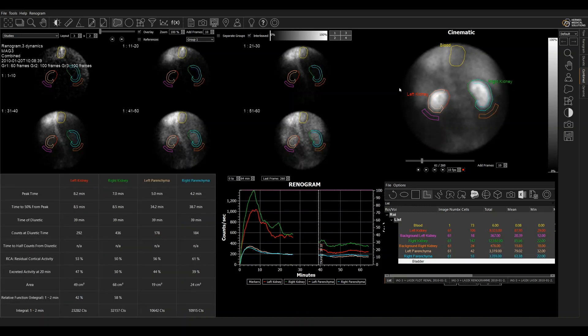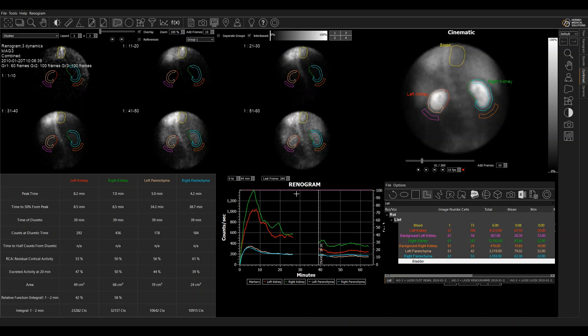So now you can see there's a nice feature in this application where if the renogram acquisition was done in two parts, either because that's the design of the protocol or because the patient was unable to stay on the camera for the full duration of the acquisition, it's possible to plot those on the same graph. And this time delay here represents the true time delay, the time difference between the end of this acquisition and the start of this acquisition.